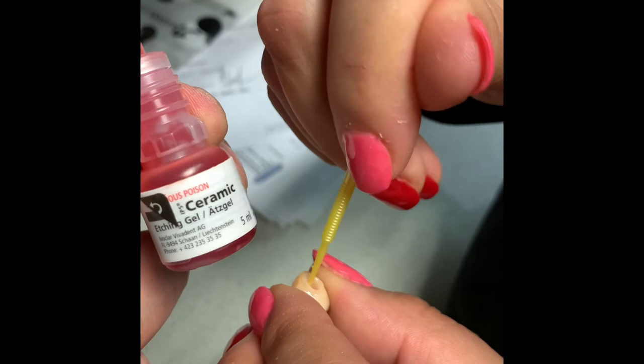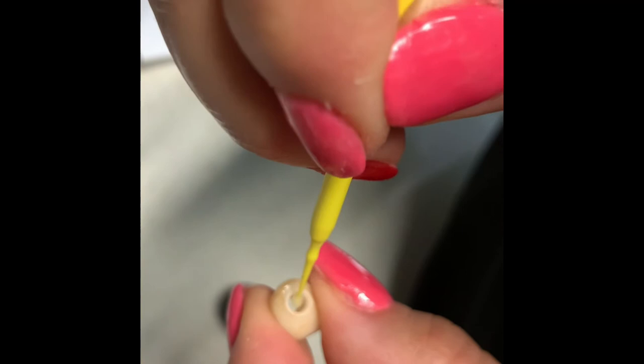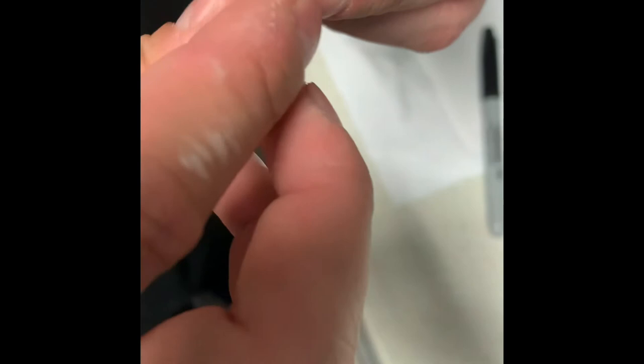Next we're just going to etch the inside of the Emacs where we're going to bond the tie base to. Just get a little micro brush and then just kind of scrub there for 20 seconds. We're using ceramic etching gel. Now we're going to Monobond the inside of the etch — same stuff that we put on the tie base — and now we want to get it on the inside of the Emacs. Scrub 60 seconds again. I have to mark the notch with a sharpie so that you can line it up easily when you grab the tie base.